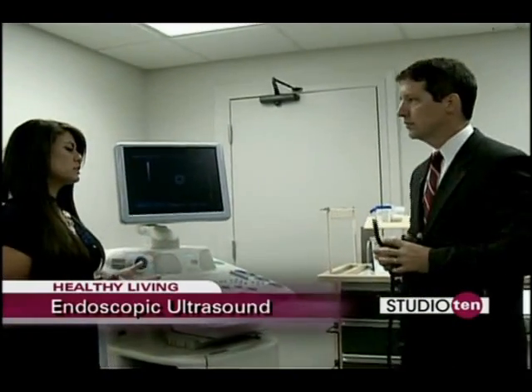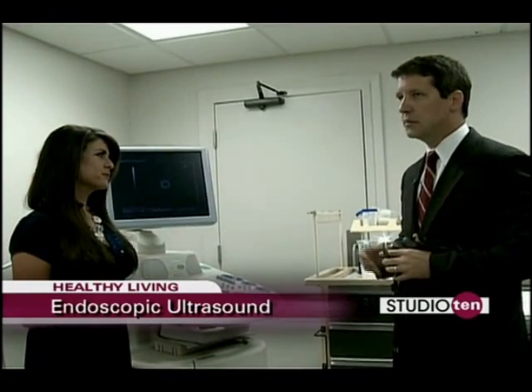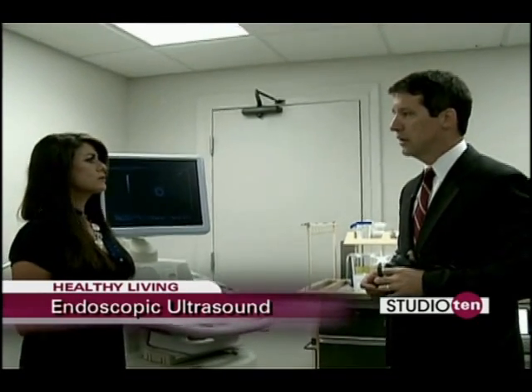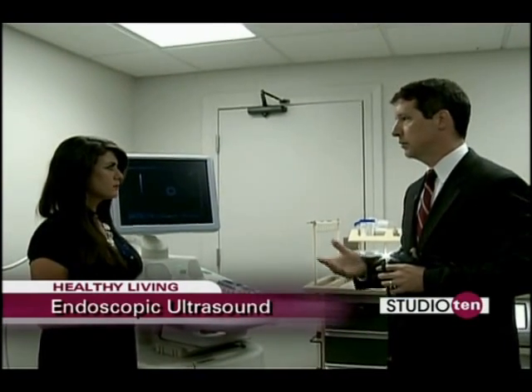So this procedure is just very detailed, giving better diagnosis for the patient. It's better imaging than a CT scan, an MRI, a transcutaneous or transabdominal ultrasound. So that's where it really has its advantages over other imaging modalities.